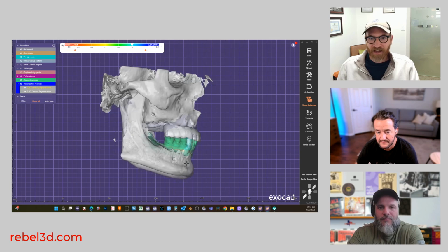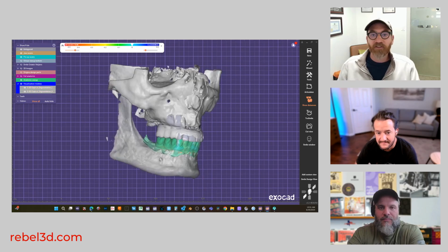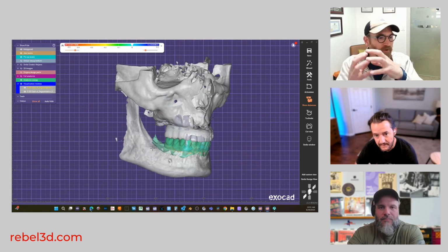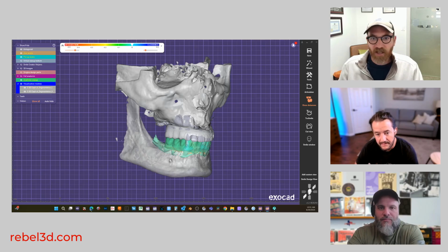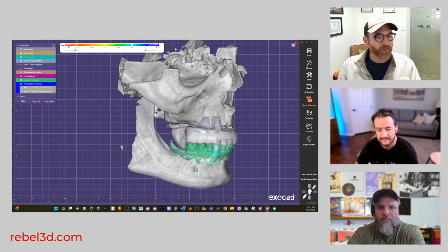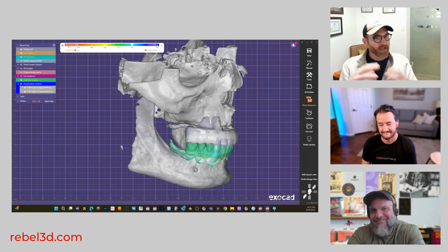So I'll have to send you some videos of the fact that he was, so if his condyle's out, right? So he had to do some sort of MIP weird thing to get his teeth together. So when I did the digital conversion, and then when I delivered the case, he was high on the right side. And so what I did is I just got the wheel out and I started grinding, right? And so I ground it down to MIP. So I had to do some significant adjustments to get him close.